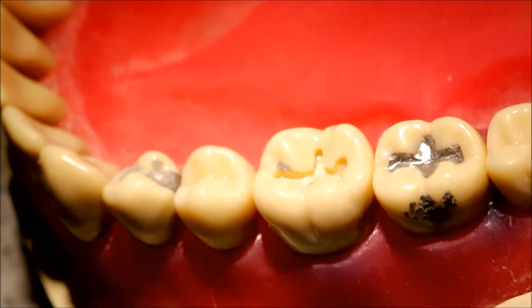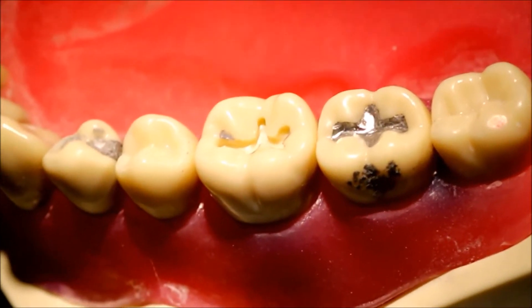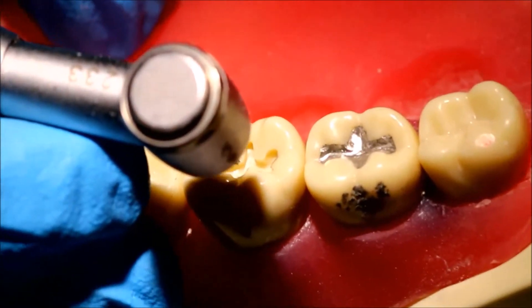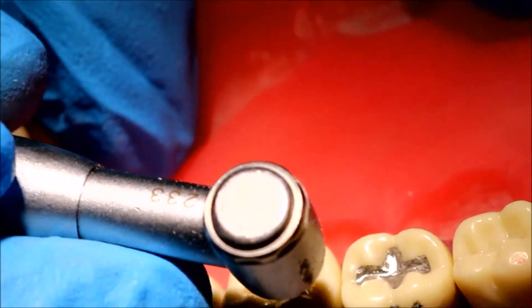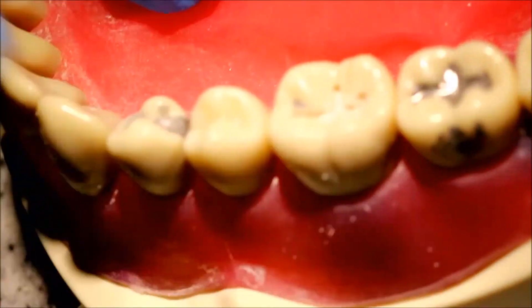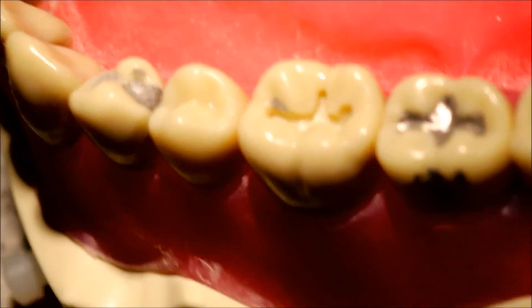At this point your prep should be more or less finished, but let's take a closer look for any problems. I noticed that in one part I did not have enough depth — this is very common especially around the outermost parts of your groove extensions. So I'm going to take my 34 and drill mainly at the ends of those extensions to ensure that I have 1.5 millimeters right at the groove extensions.